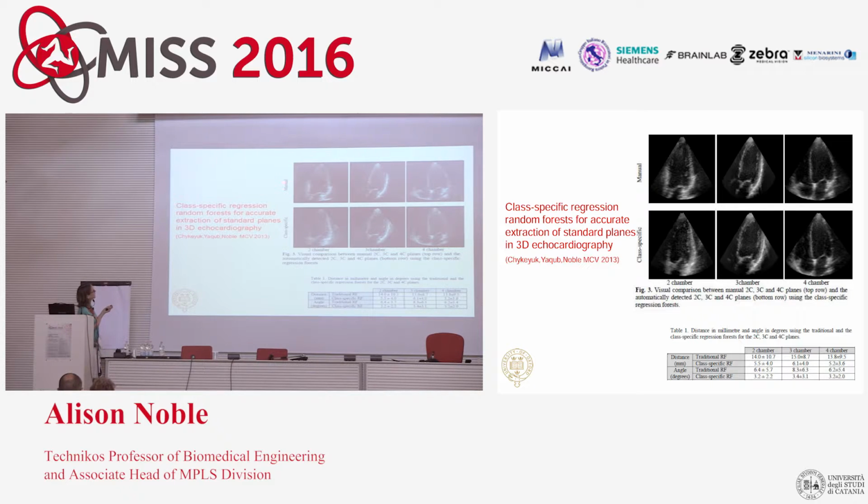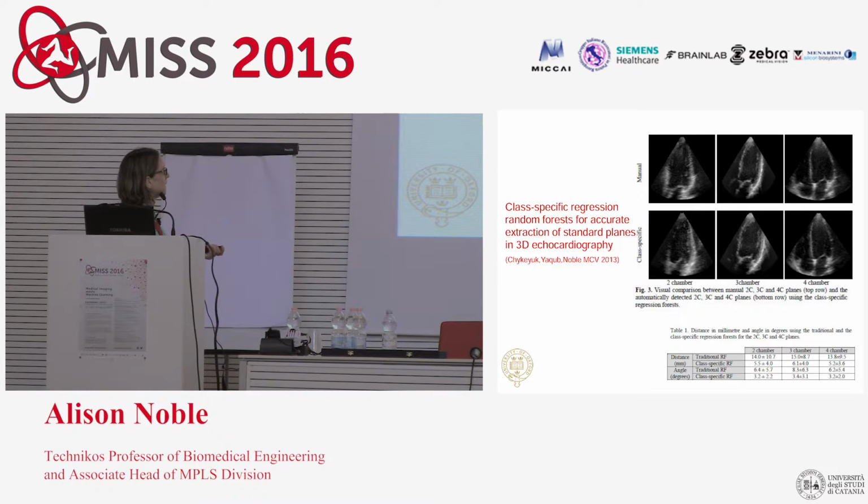What's shown here is a comparison of the manual plane extraction with the class-specific one. Even though you're not experts in ultrasound, you can see similar acoustic patterns around these chambers, so from an appearance point of view, the images are quite similar. You can also translate it into millimeters and angles, which is what in our field we like to do. We like to quantify. If you present this to clinicians, they're not so excited by it because they don't actually find planes and use these numbers. What they really care about is whether they can find the diagnostic information quickly.